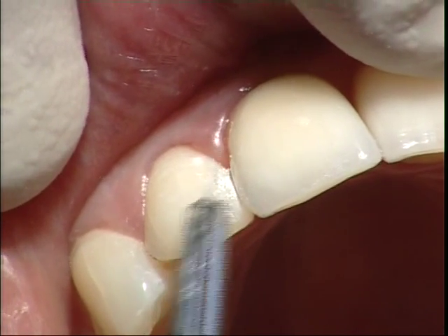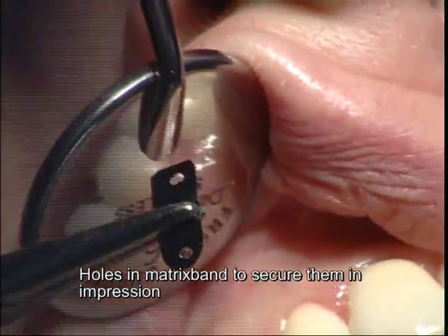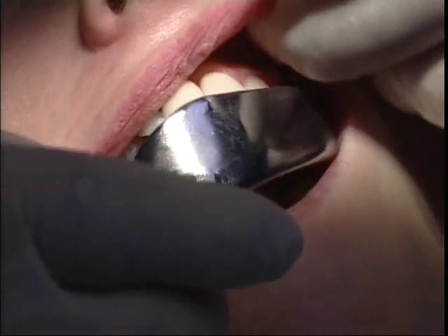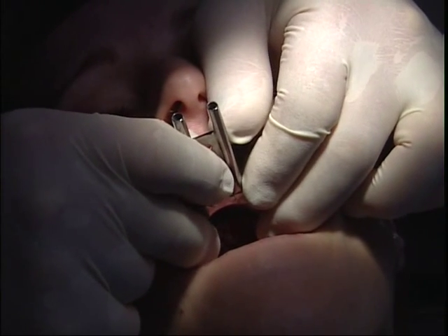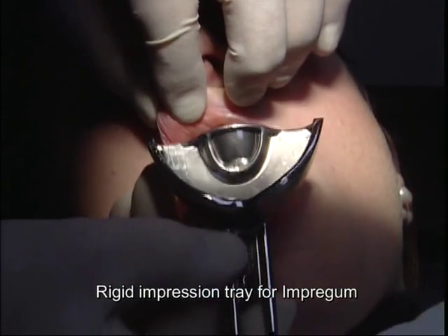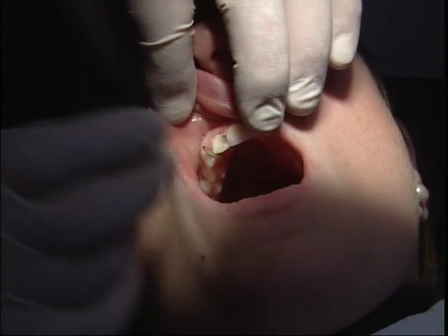I will just open up the contact points so that this one will come out. With the holes in the matrix band, we are trying the hydrocolloid tray. We are not going to take a hydrocolloid impression, but the hydrocolloid trays are perfect since they are very rigid. When you are using materials like Impregram, which we are using all the time for these techniques, you need rigid trays. There are no rigid trays that are more rigid than hydrocolloid trays. You don't need any extra retention beyond the various anatomical details inside the trays. Now you can see both matrix bands with the holes in place approximately. It is very important that the tray does not interfere with the matrix bands.